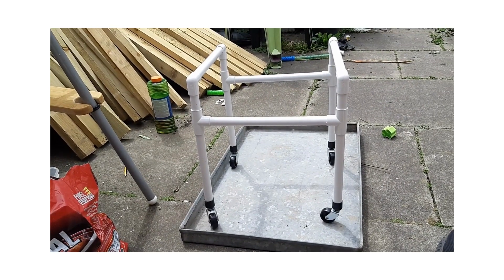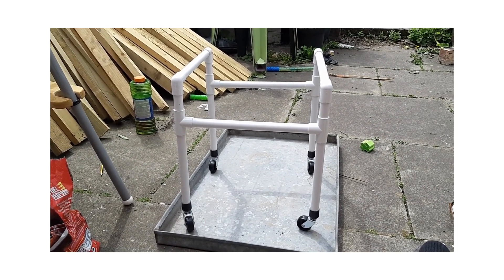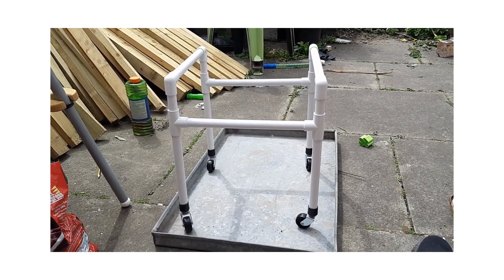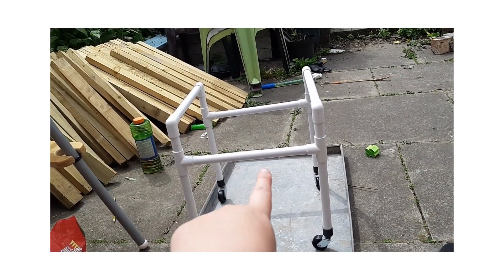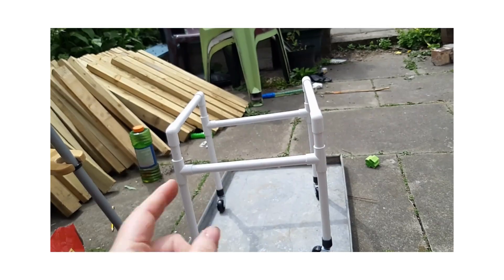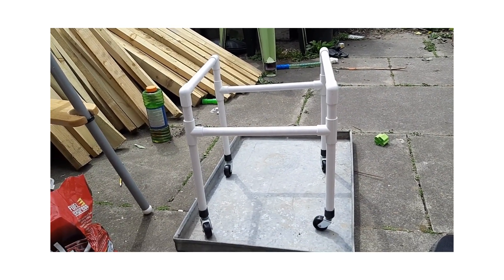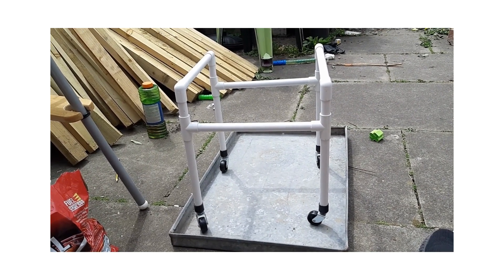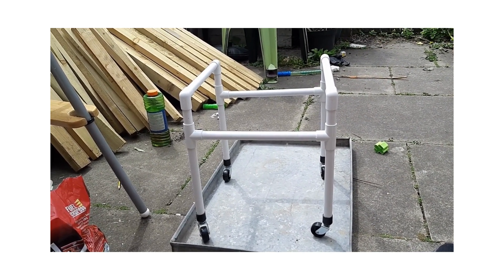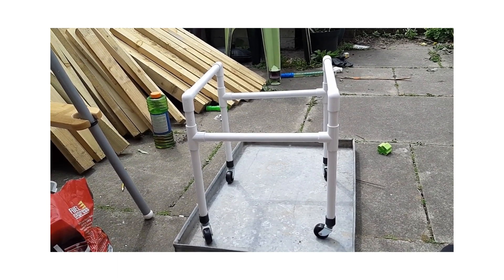So that - excuse the absolute mess in the garden - is the frame for the chicken wheelchair. The final stage will be to make the sling part, which I'm going to do at my mum's house this evening. And then I will show you the final thing, and then if we can convince Sarah to get in there and stay in there, that'll be interesting.